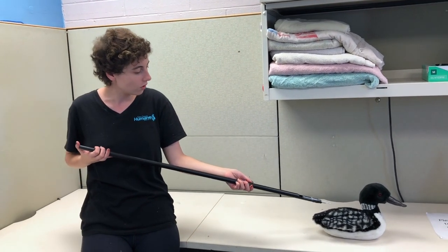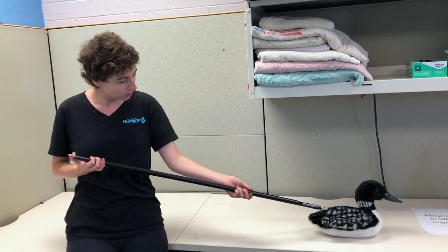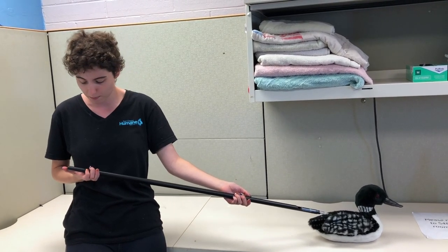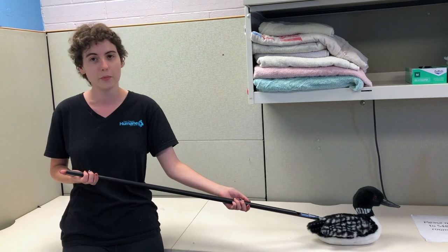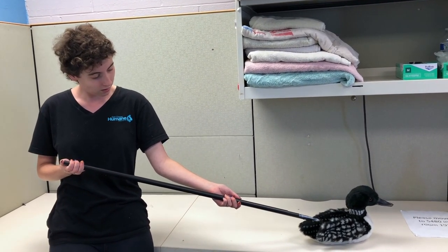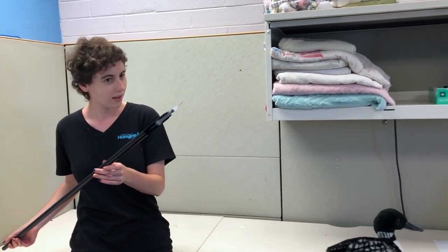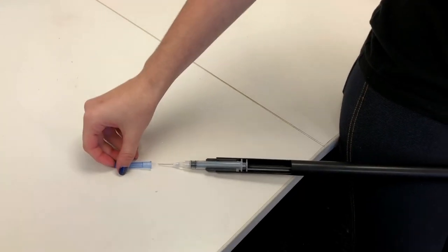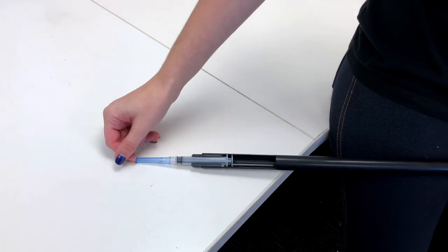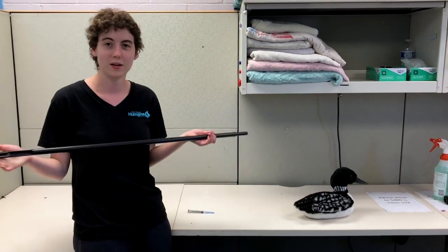You'll slide in to inject, and then once you have punctured the skin and are in correctly into the muscle or just sub-q depending on what you're giving, you just gently depress. The medication injects, you pull out and you're all done. We will carefully recap our syringe, then remove it from our pole and we're all done.